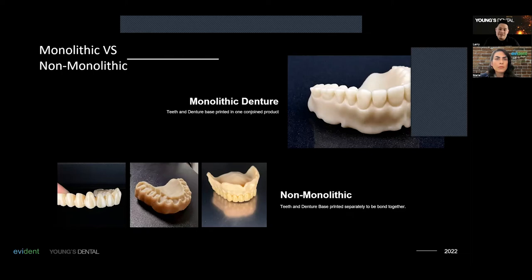Okay, so if you were to compare it side by side, I'm just going to throw a brand out there. So you have the CEREC milling a posterior crown, and you compare that posterior molar to a Dofcraft 5-axis milling machine, for example. There is no comparison because the Craft 5X uses a 0.6 millimeter burr so that it can get that pit and details so beautifully. And that's another lecture that we can get into in terms of difference of milling machines and the quality of the product from 5-axis, 4-axis, 3-axis, and also burr size.